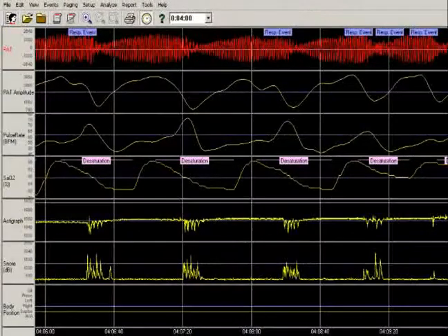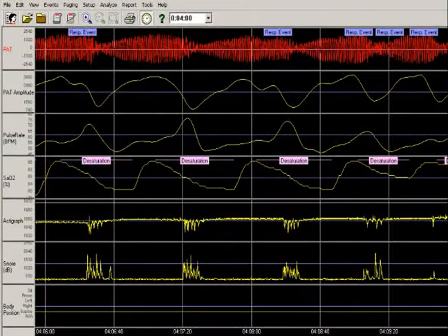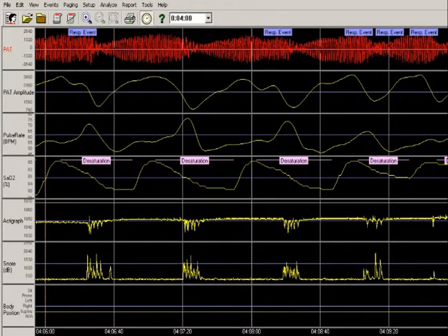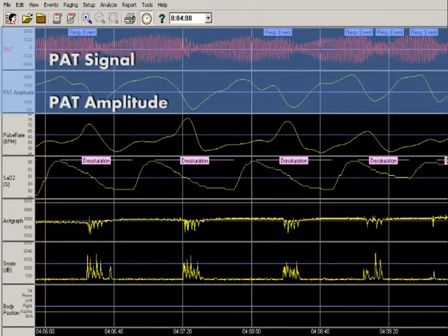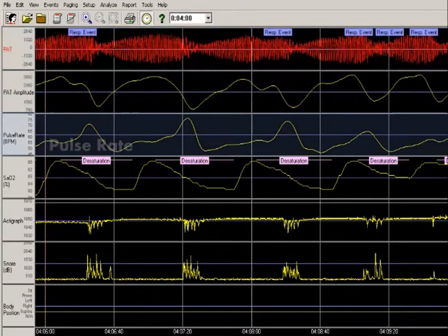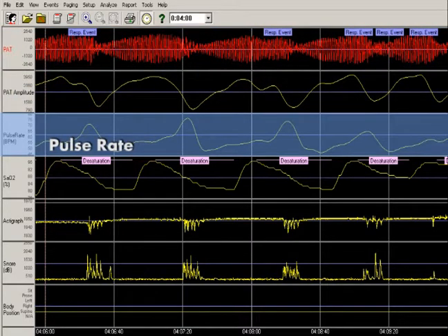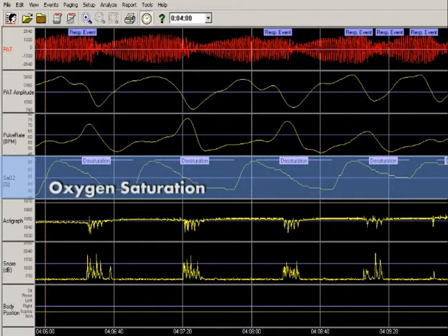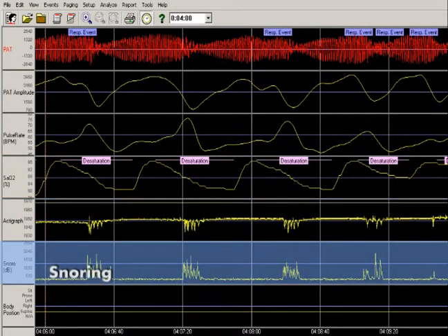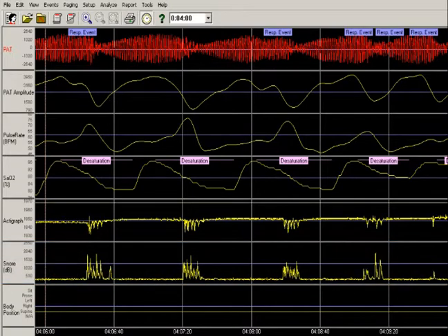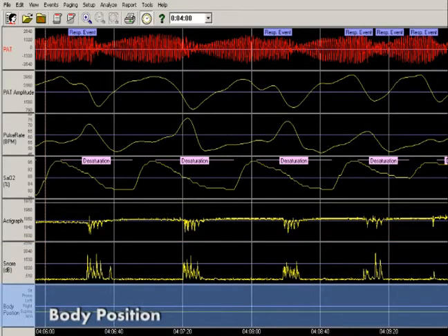WatchPad provides six physiological signals which include PAT signal and amplitude, pulse rate, oxygen saturation, actigraph, snoring in decibels, and body position.